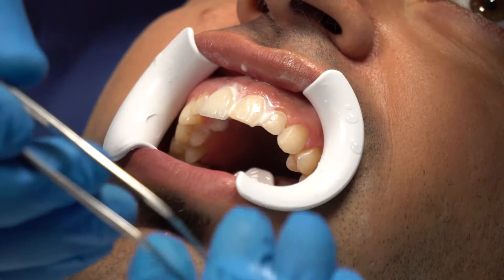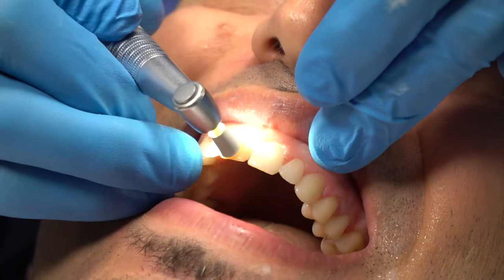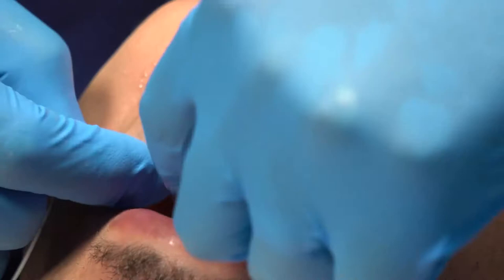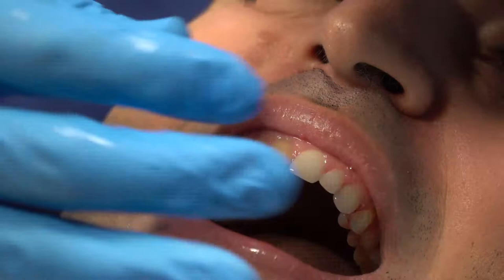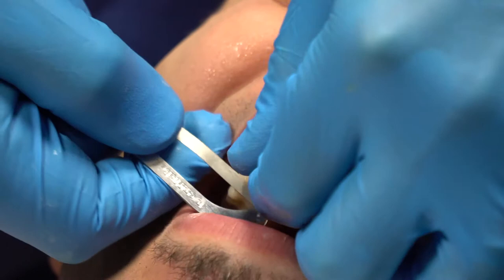Let's rinse real good and then go polish. We use the Denmat polishing paste — it's not fluoridated, so that's the good way. If he has preoperatively tight contacts — those are pretty tight. A trick I've learned over the years: if you have a really tight contact, obviously this contact will open up easily because there's no contact, it's just the veneer. But back here he has some tight contacts, so I might go through once or twice to make it easier to clean out the contacts when we finish.